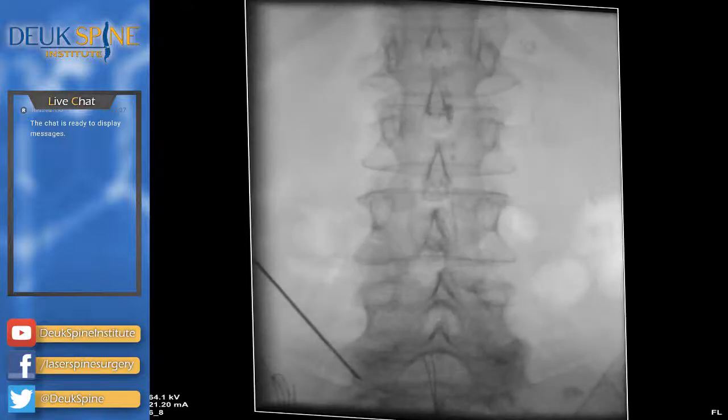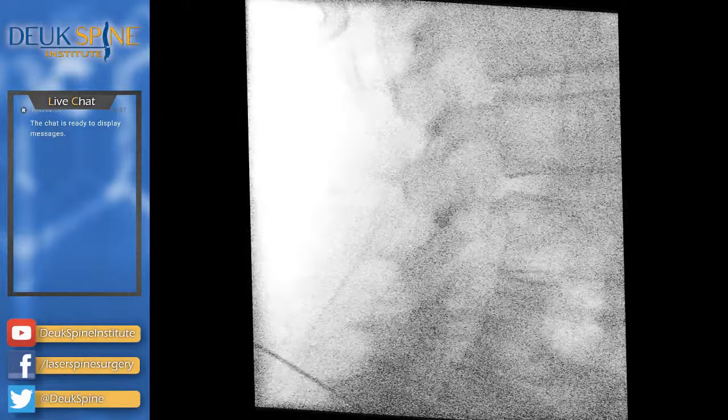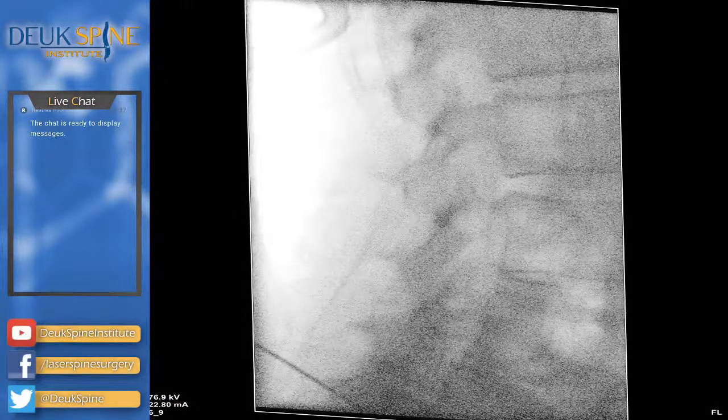Man, I don't know how you got that lateral, but that is absolutely amazing. Like I say, better to be lucky than good. Hey guys, not too close. That looks good. Go back to a lateral. Everything's going good, okay? Need to be further south.